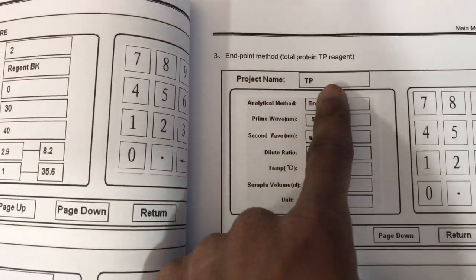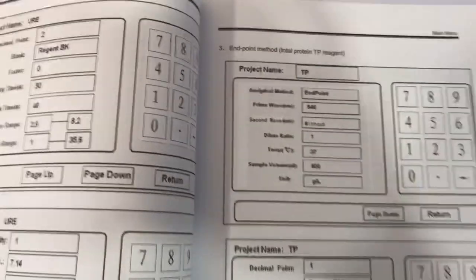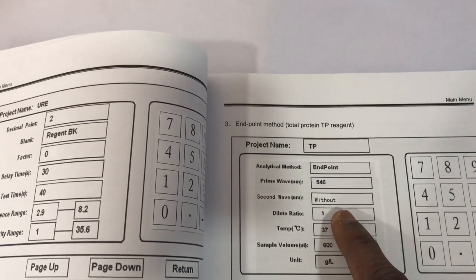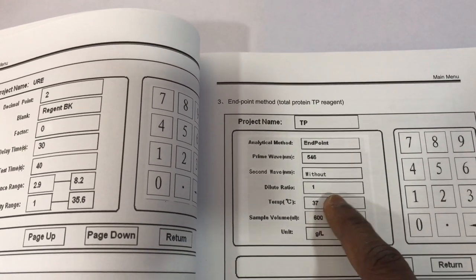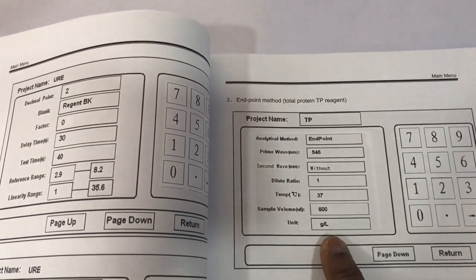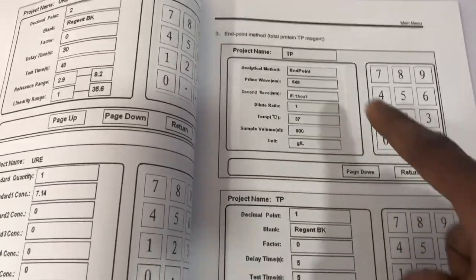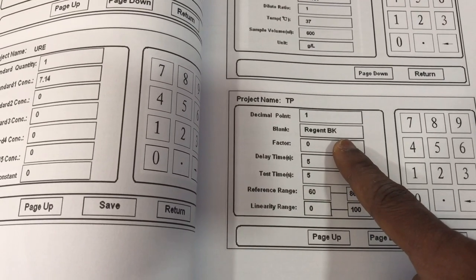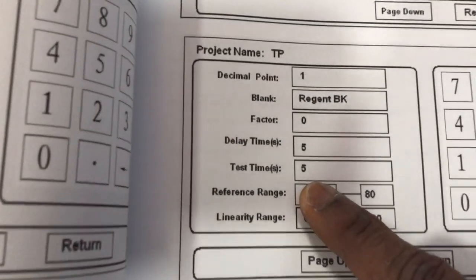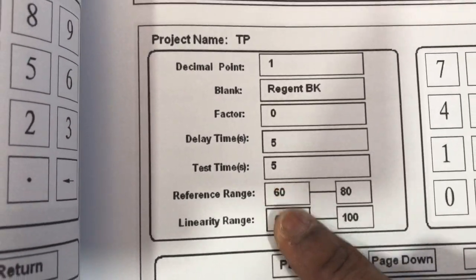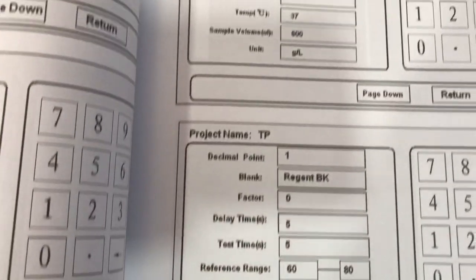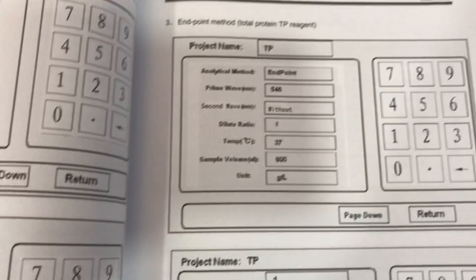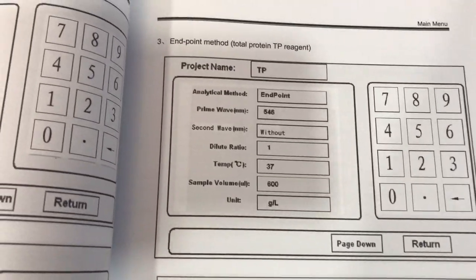Here is another endpoint method — total protein. The analytical method is endpoint. The primary wavelength is 546 nm; there is no secondary wavelength. Dilution is set to one. Sample volume is 600 microliters and the unit is g/L. On the second page, set the decimal point, do a reagent blank, and leave the factor at zero. The delay time and test time are both five seconds for an endpoint reaction. This is the reference range according to the manufacturer.